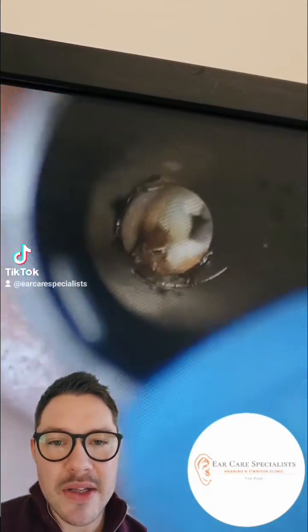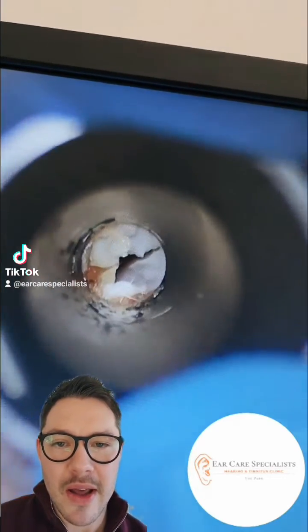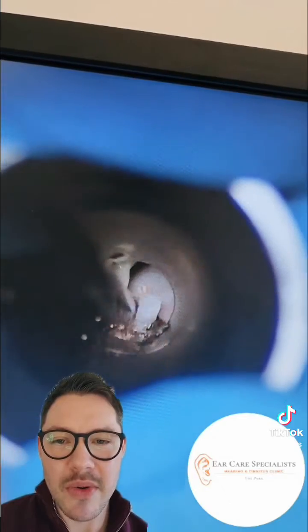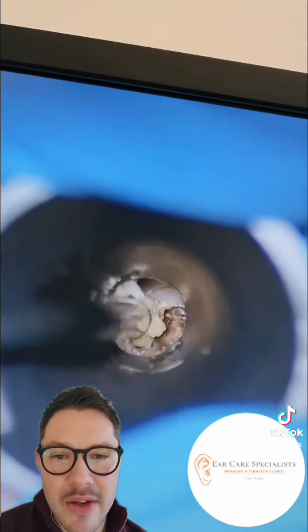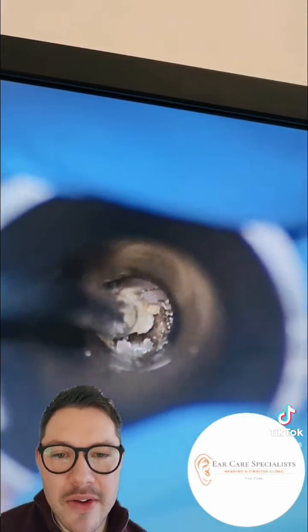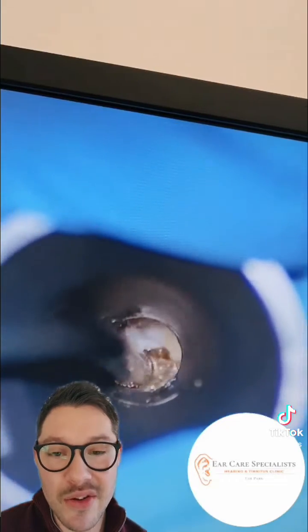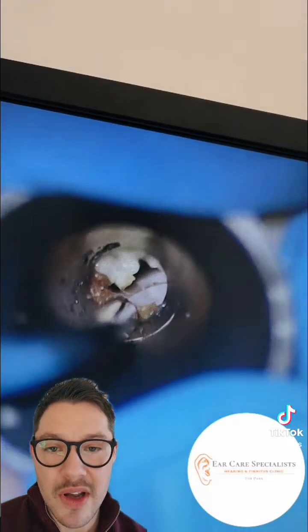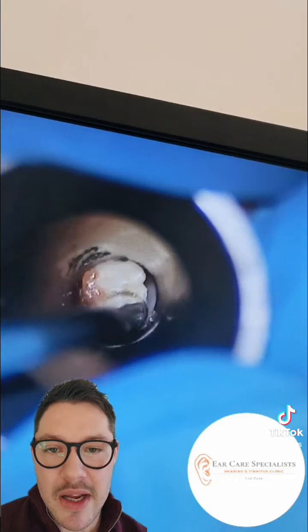This is just skin that's lined the ear canal and it's just started to shed away. The reason it's this color is the patient has been using quite a lot of sodium bicarb drops. These will really fizz away and start to dissolve the wax and the skin debris, but it doesn't tend to get it out of the ear. It's good for softening, but not in everyone — some people's wax is already naturally quite soft and doesn't really require any further softening agents.